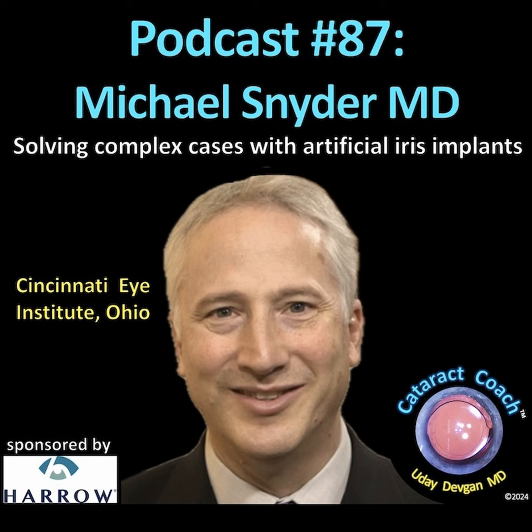And these people also, interestingly, get mydriatic issues because their sphincter muscles also just kind of collapse. And so they do really well with iris prostheses. And then there's the patients with Rieger's anomalies and so on and so forth. Interestingly, what we see a significant number of, but not a large percentage, is people who have had IFIS. So we've all had cases of IFIS where the temporal iris just gets damaged at the time of a cataract surgery, and they lose a ton of pigment.